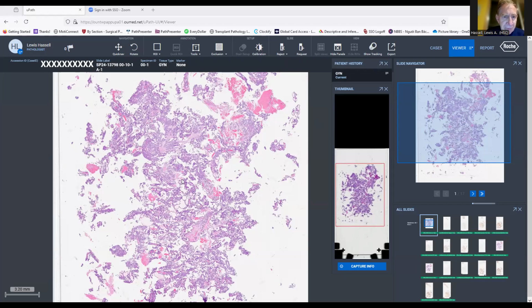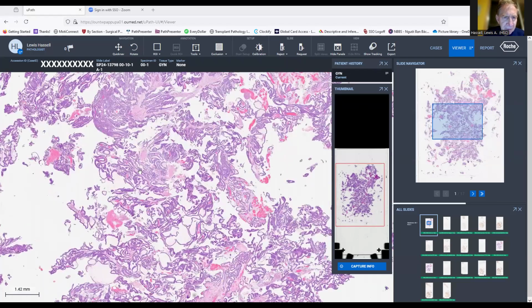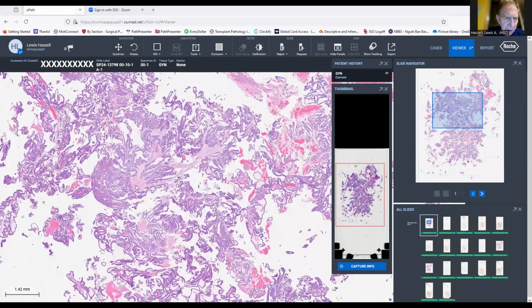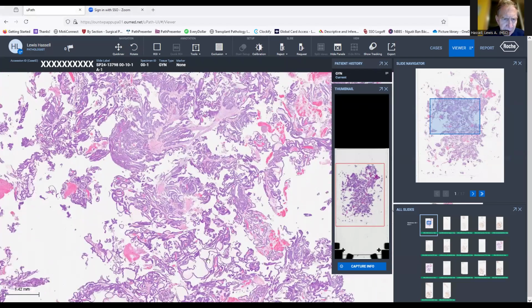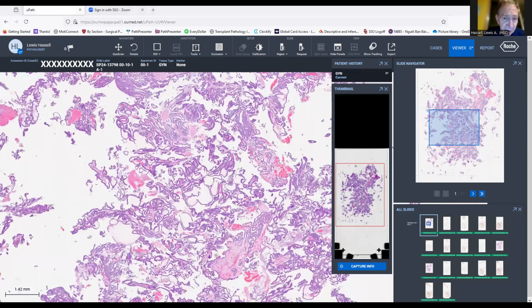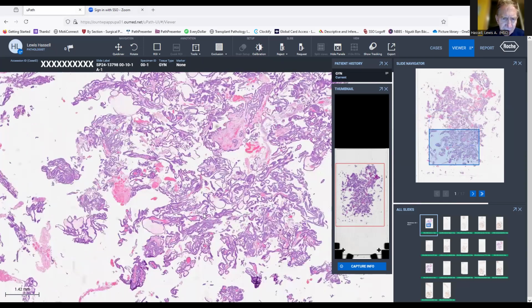As we look at this, we see a very complex glandular proliferation with a lot of very simple glands, elongated, almost papillary structures, as you see here. And I think you can appreciate at low magnification, there's a bit of hyperchromasia as well, but no real solid growth, a little bit of maybe polypoid, almost villiform in areas.